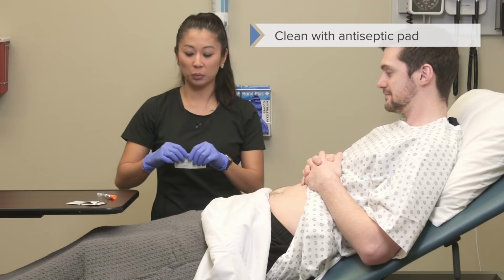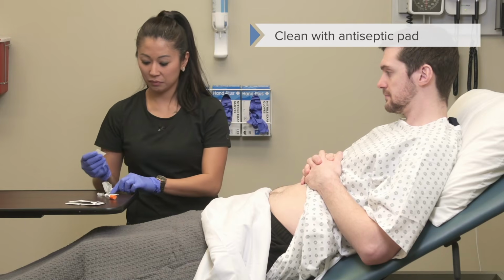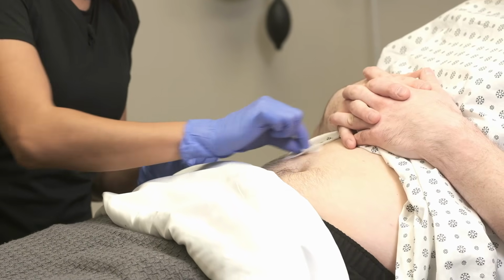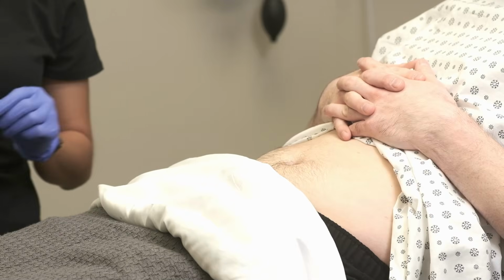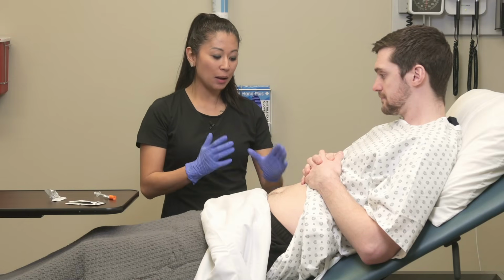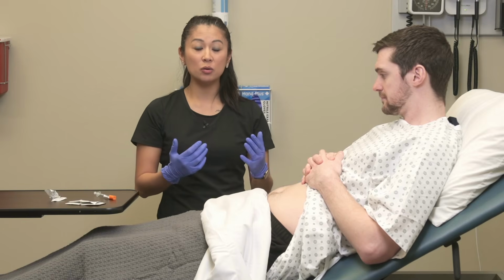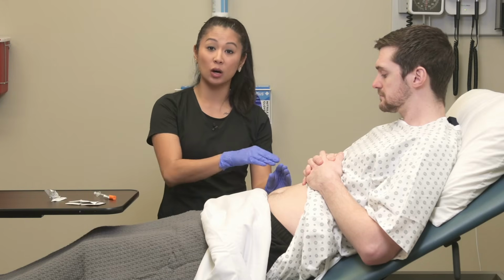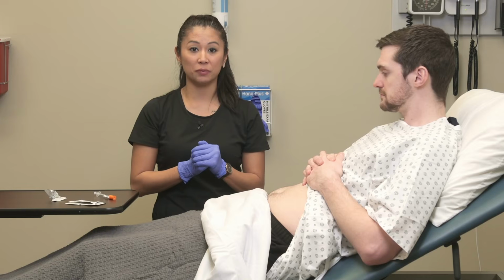All right, so now we're going to prepare our site, and we're going to make sure we clean thoroughly. So this can be kind of cold for your patient, so make sure you scrub and clean your site appropriately. Then when we go to give the injection, I'm going to grasp the patient's skin where I'm going to inject. So when I do that, I don't need to pinch really hard or pinch really narrow because I don't want to get my fingers in the way. I also don't want to make it painful for the patient.